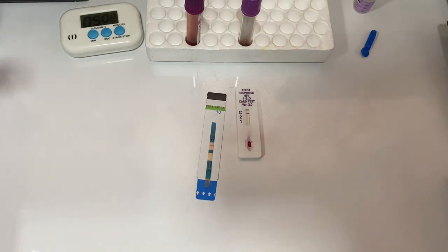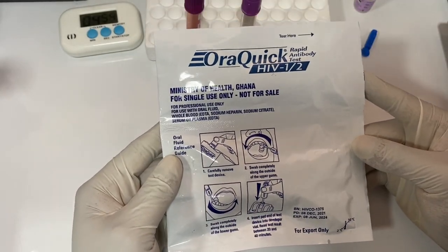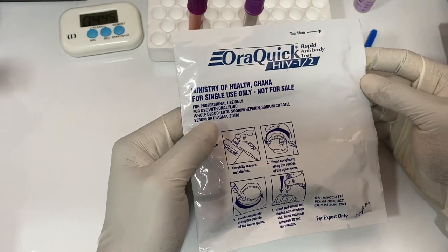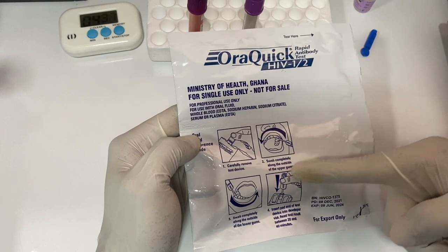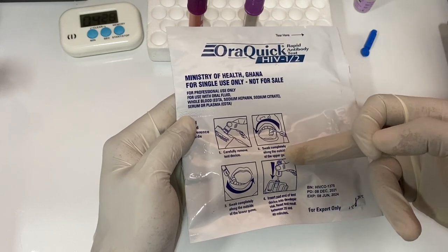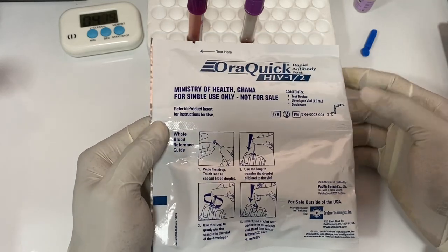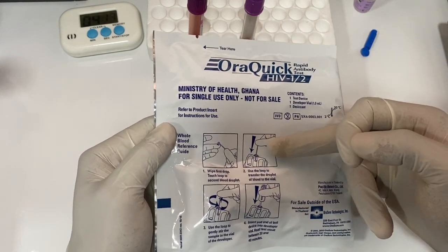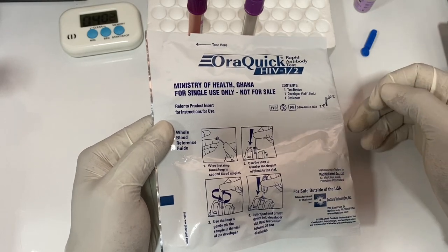Let's look at the OraQuick — it's also very simple. You can use a mouth specimen or blood. To use a mouth specimen, you open the OraQuick, take out the stick, and swab completely along the outside of the upper gum, then do the same for the lower gum. The kit has a buffer included; you put the swab stick into the buffer and wait 20 to 40 minutes. You can do the same with capillary blood or whole blood — pick some capillary blood with an applicator, put it into the buffer, stir it, then place the stick into the preparation and wait 20 to 40 minutes.